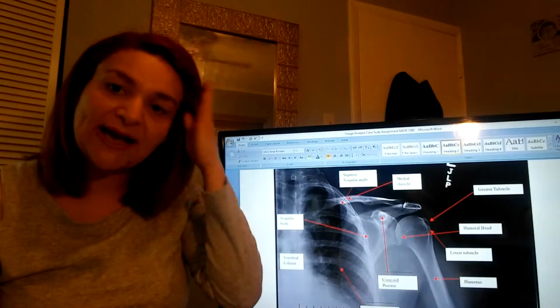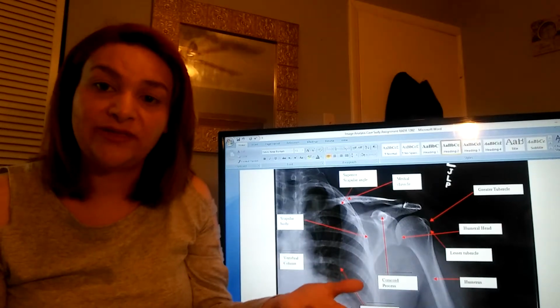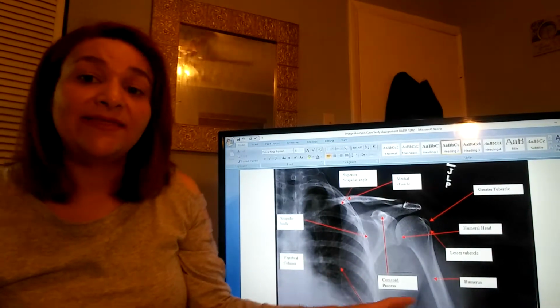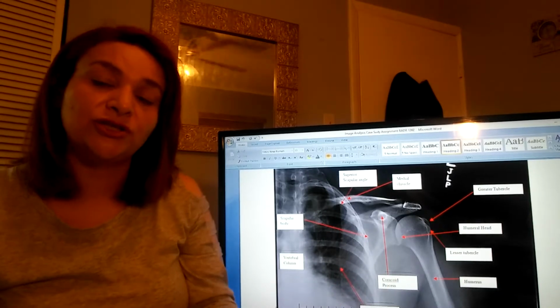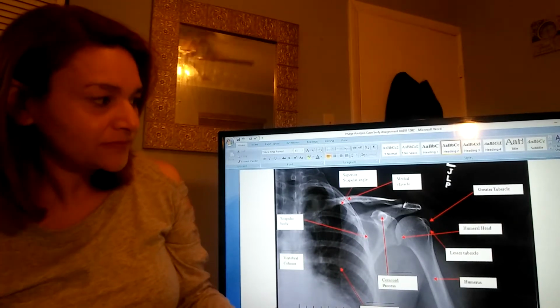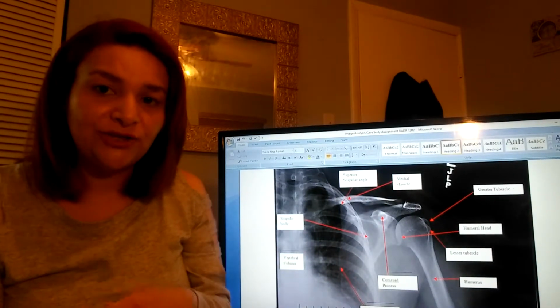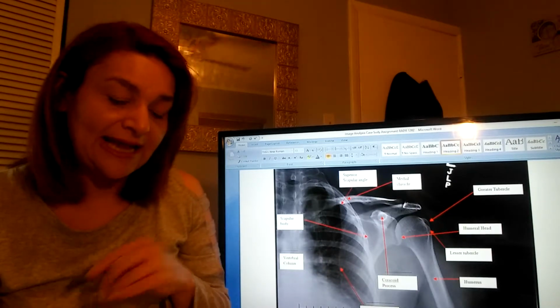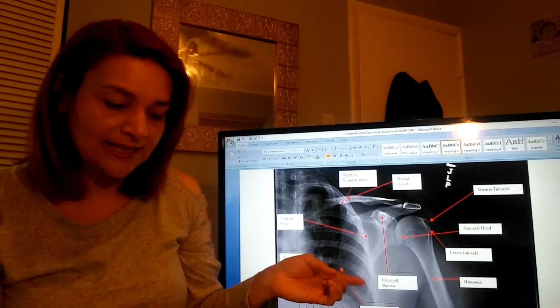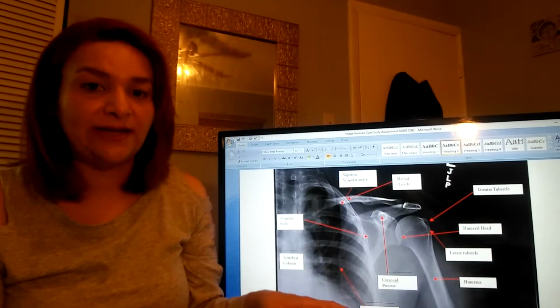Before walking away, I let her know that when directed, I was going to tell her to hold her breath and to hold still. I then placed a standing shield in front of her to make sure to shield her from the waist down. So I walked back to the control panel and I did use an AEC, and the AEC shot at 80 kVp at 10 mAs. My exposure index was at 293, which was in the hospital range.